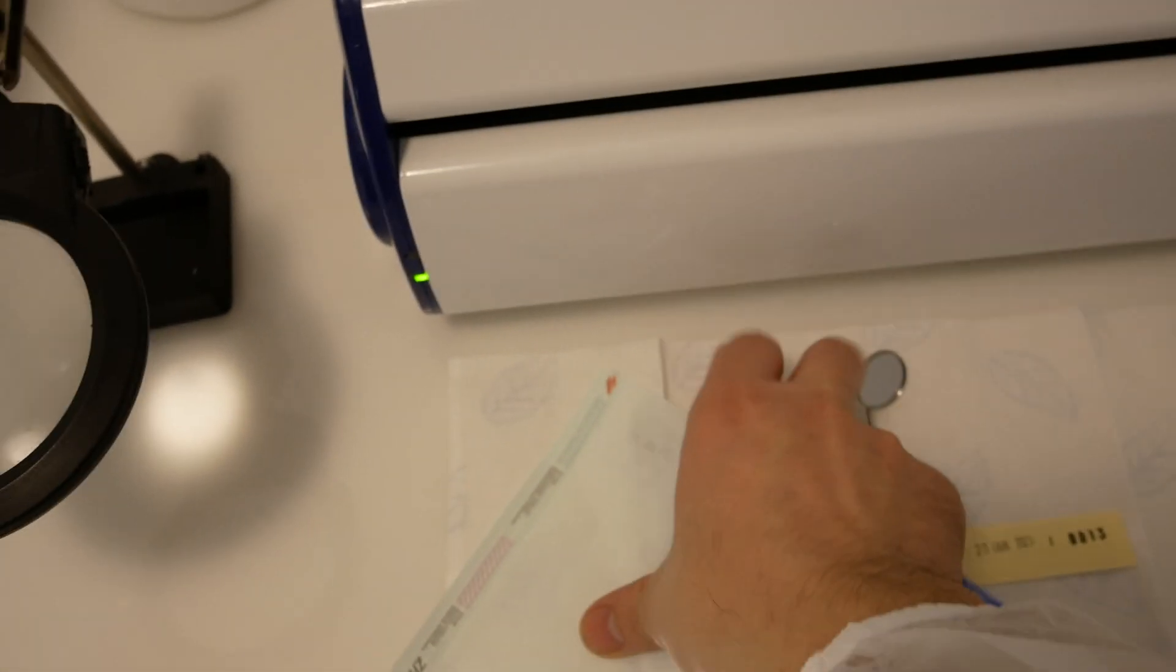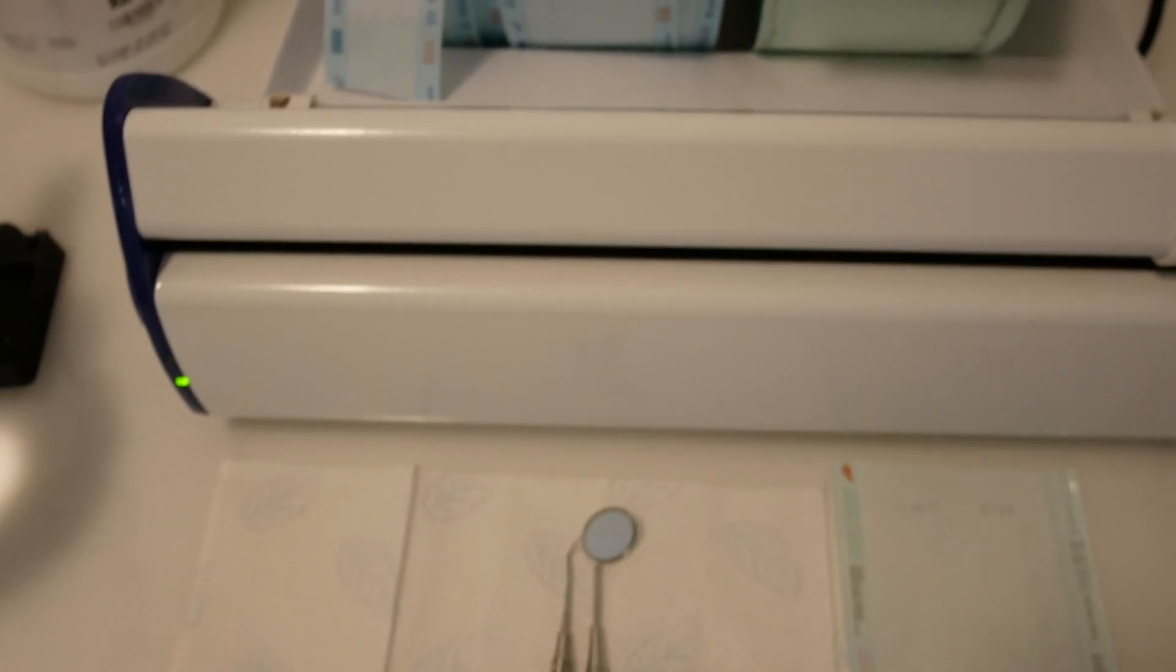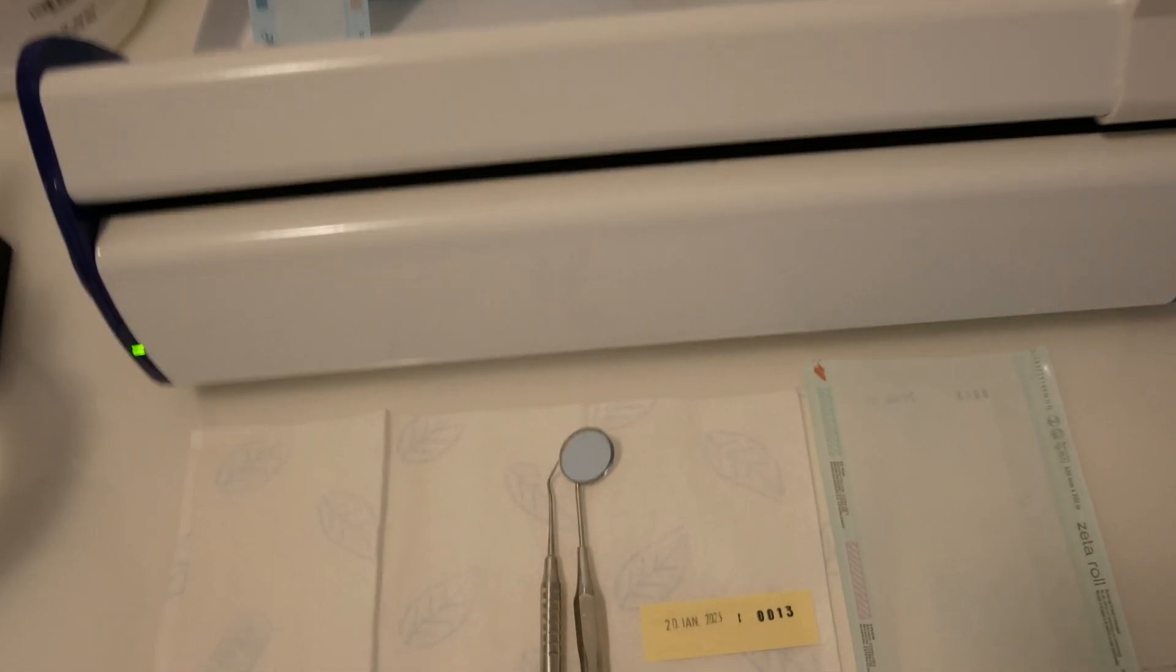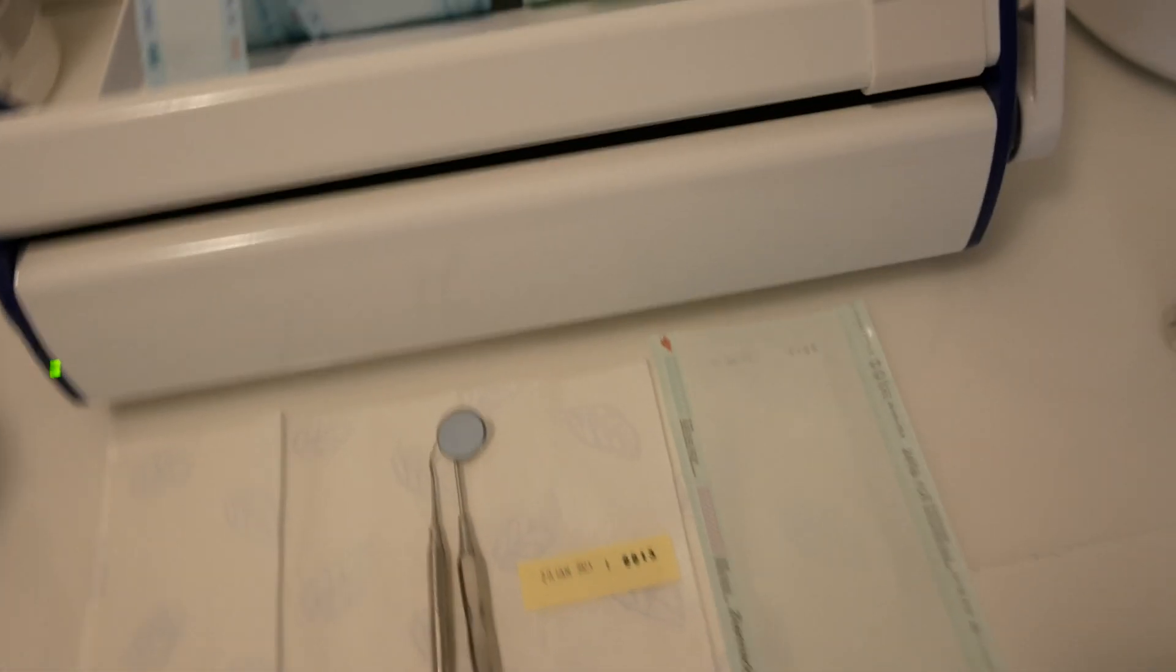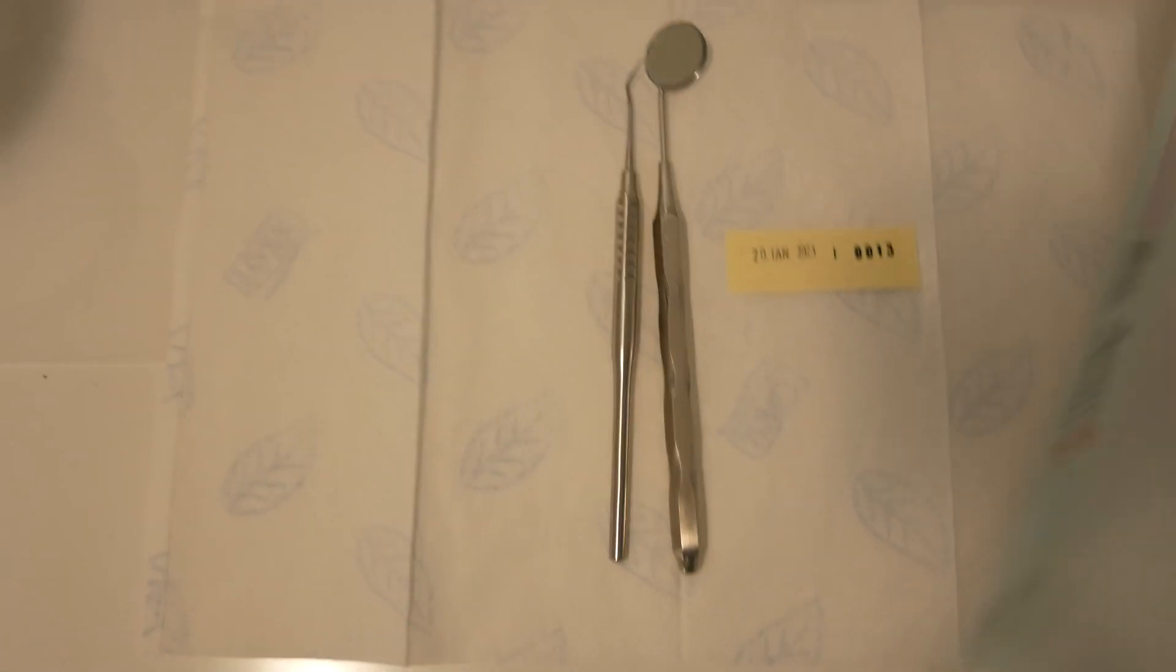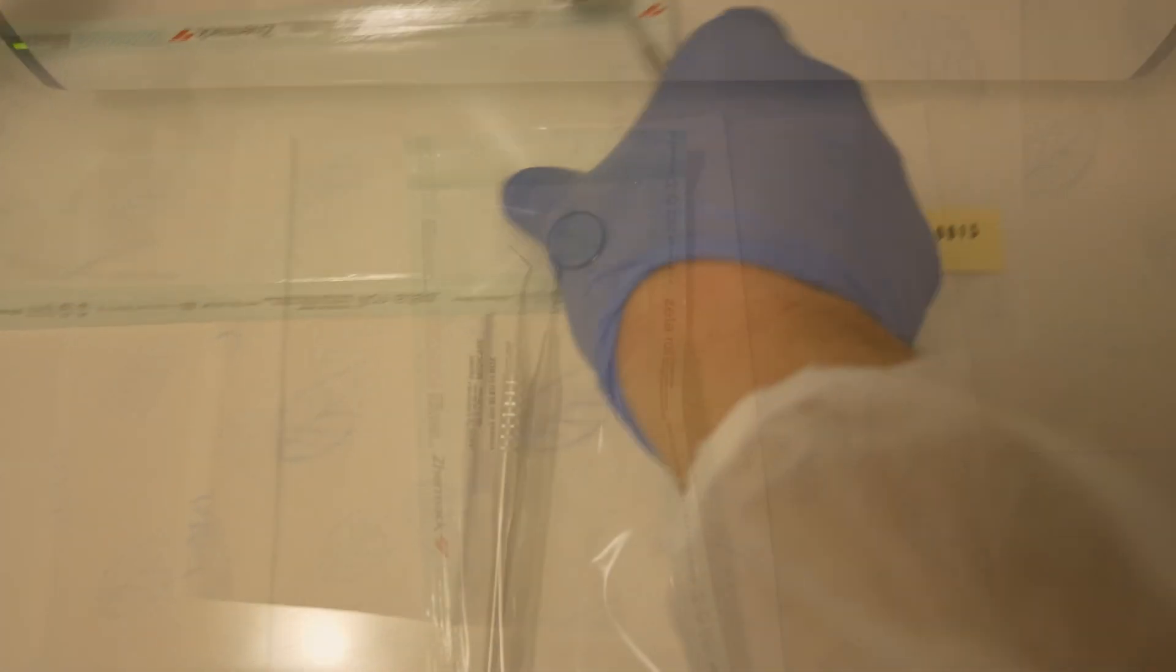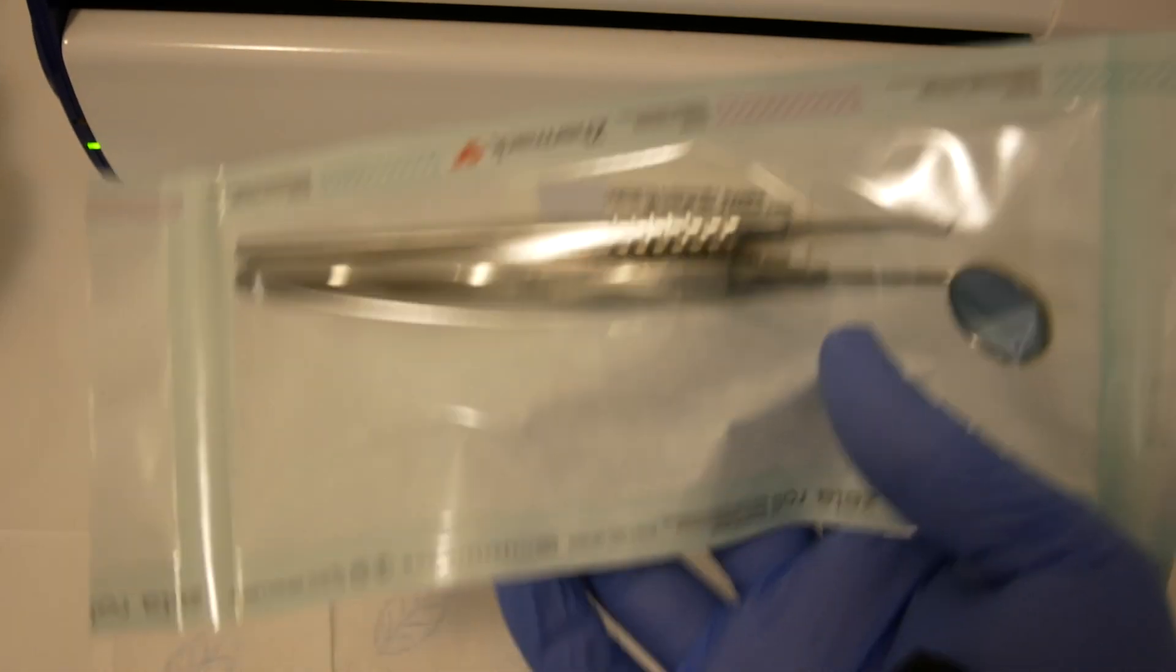As you can see, I have my pouch pre-sealed at one end. I do this before starting to process the instruments as I find this easier. Of course, without filming, this is a lot easier. So I place my instruments in the bag. Okay, so we seal the bag with the class 5 indicator strip inside.